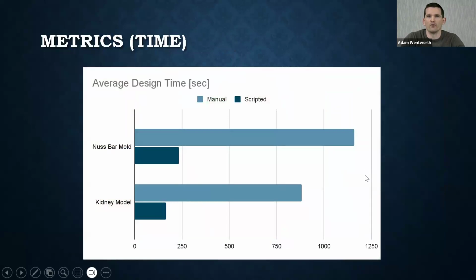We have a performance type script which runs alongside all of these and collects data in the background. So it logs how much time the script is running for, who ran it, and what script it was. And that enabled us to generate this data.